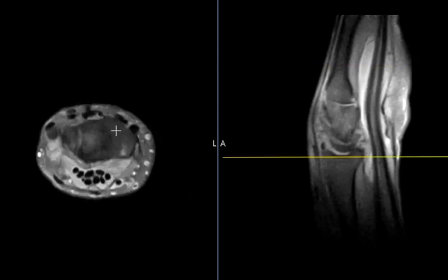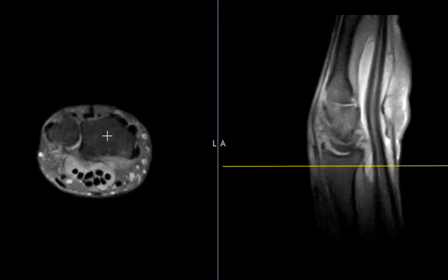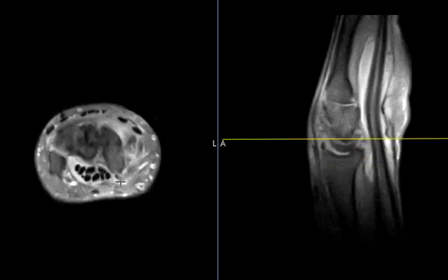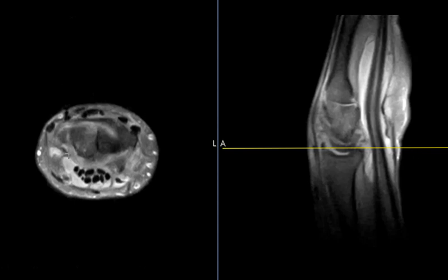Now we're going to take one look here. This is the ulna, radius, or the proximal wrist. These are those flexor tendons. This is that tendon that goes to the thumb. So again, this is the radial bursa. This is the big ulnar bursa.